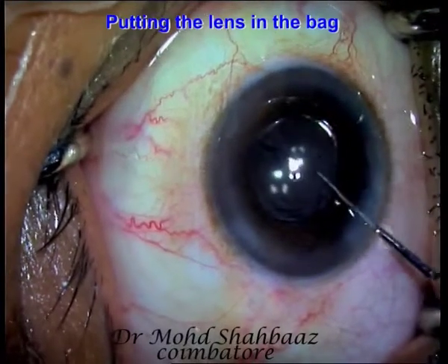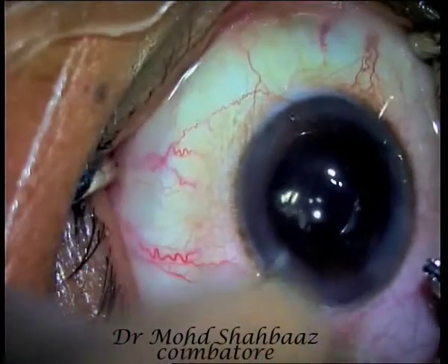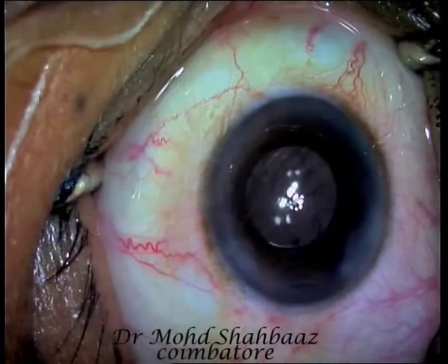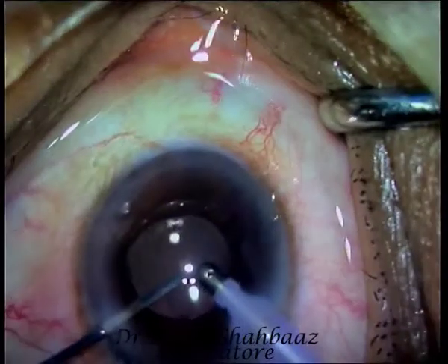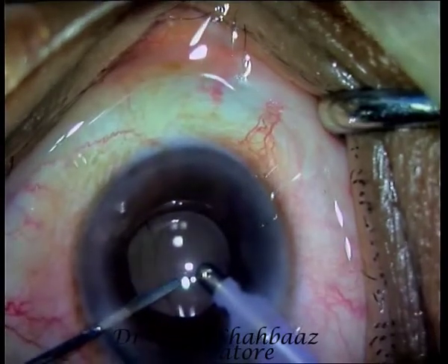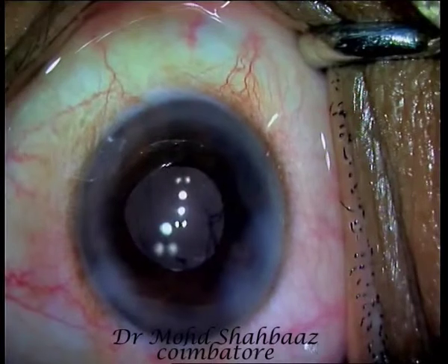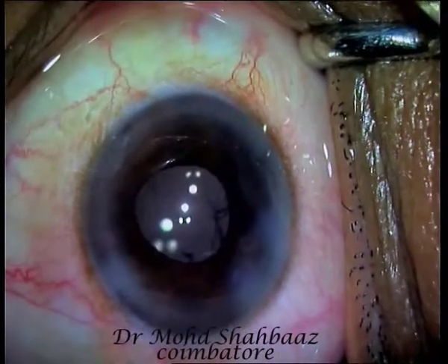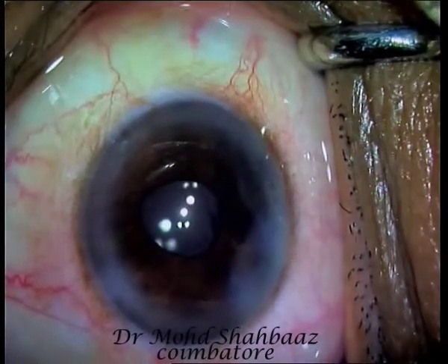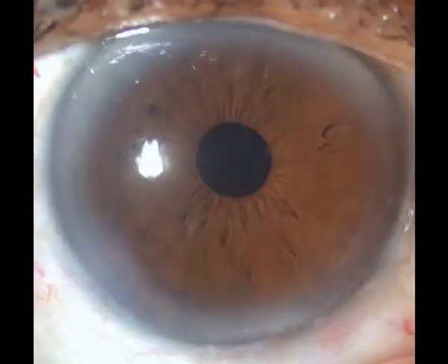Some amount of the vitreous will be there in the anterior chamber. So now I am using anterior vitrectomy to clear the vitreous from the side port and the section. After doing this, I use pilocarpine to constrict the pupil and then irrigation aspiration, hydration of the side port and the main section, using 10-0 sutures to secure the main section. At the end of surgery, we can see a well-centered IOL.